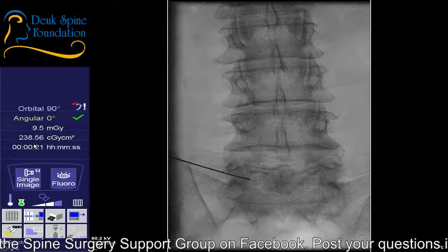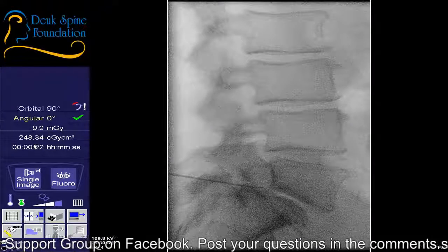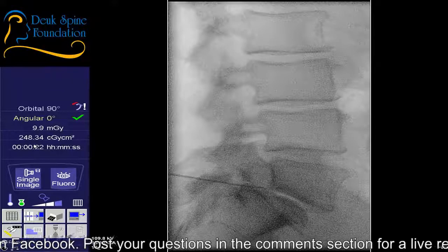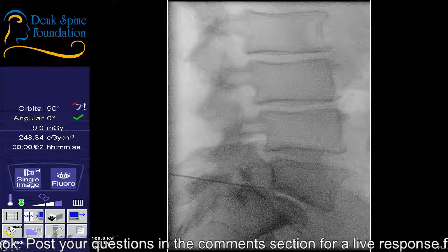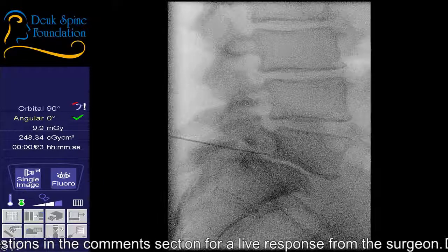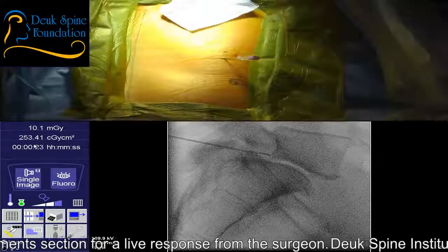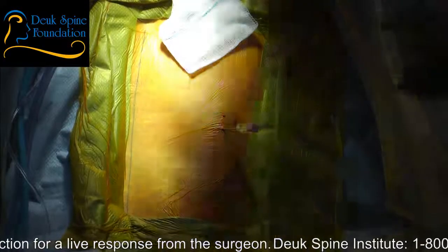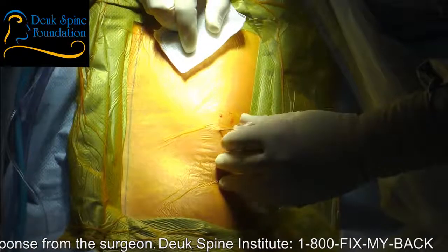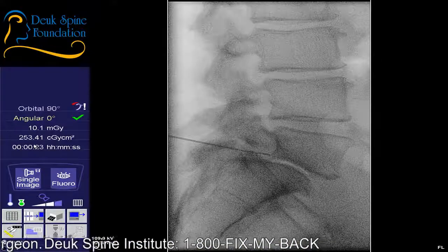Are you comfortable? So we're right there. Let's try to wag a little bit. Release the wag. That seems to be better right there. Lock it in. All right. Are you still comfortable? I'm not happy. I'm probably going to have to come in a little bit higher up.